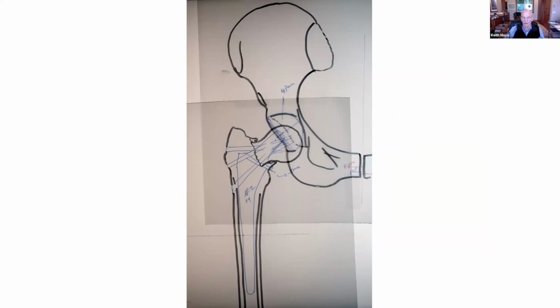Should mention that if you're planning for every eventuality, this was also planned for a primary total hip in case I had difficulty getting the screws out. So if you only want to have one intervention and the age group is appropriate, then you have to provide a prosthetic alternative as well. You won't always have a good normal side to plan to.